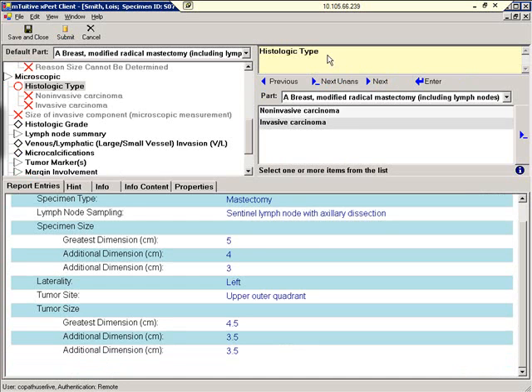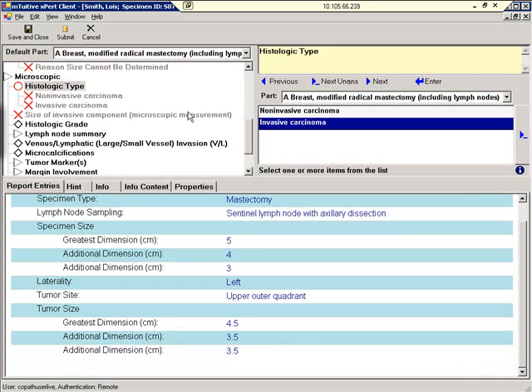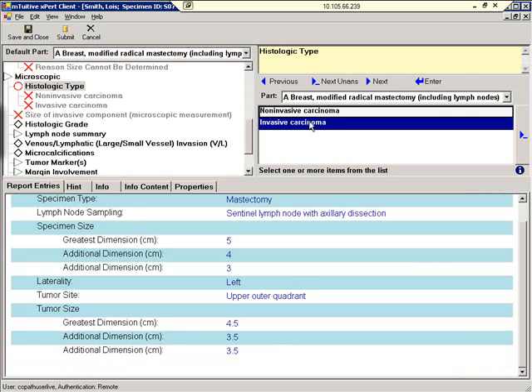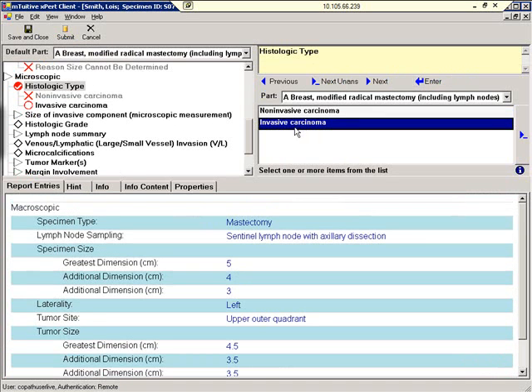Histologic type. In a moment, we're going to select invasive carcinoma. But as you can see right now, noninvasive carcinoma and invasive carcinoma are both turned off. Let's click enter to select invasive carcinoma. Now that I've made my selection, you can see that noninvasive is turned off.